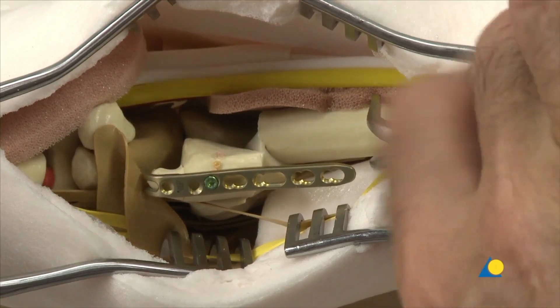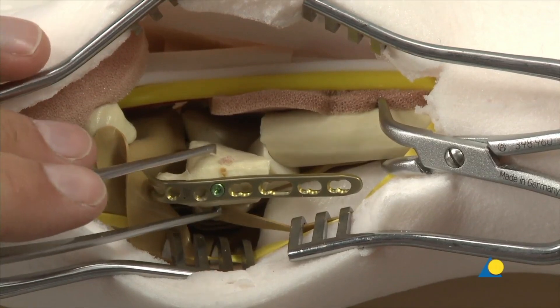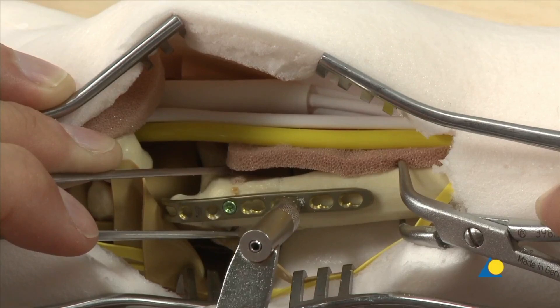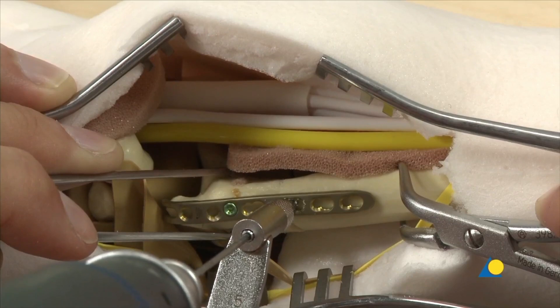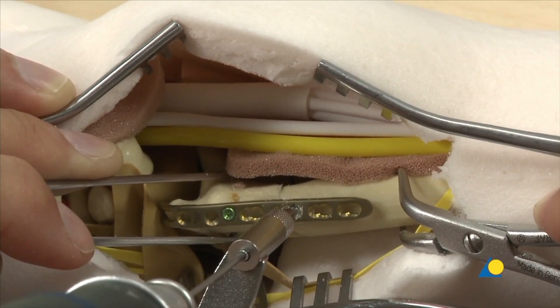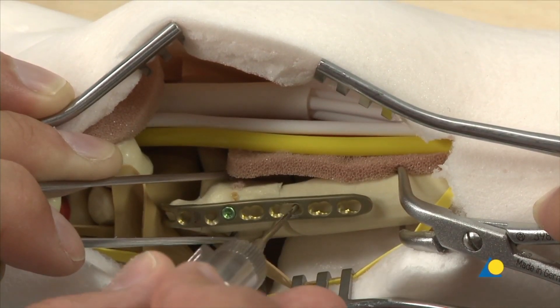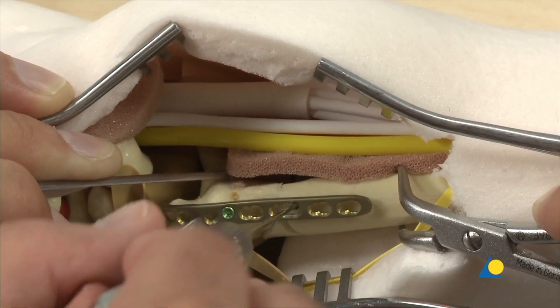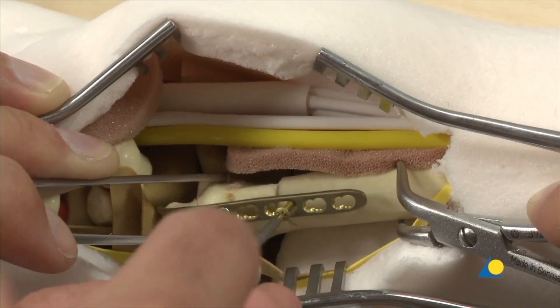The ulnar shaft is held with the pointed reduction forceps and the ulnar head is reduced to the shaft. The 2.0 universal drill sleeve is inserted into the oval plate hole in a neutral position and a 1.5mm screw hole is created. The depth is measured and a 2mm cortex screw of appropriate length is inserted and fully tightened.